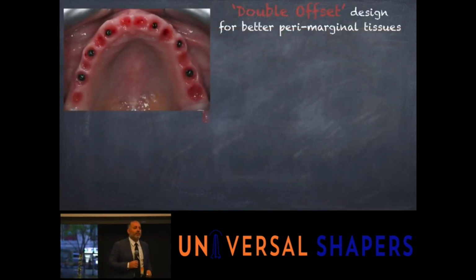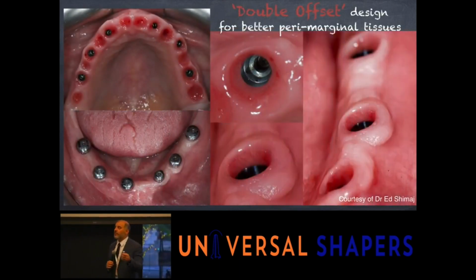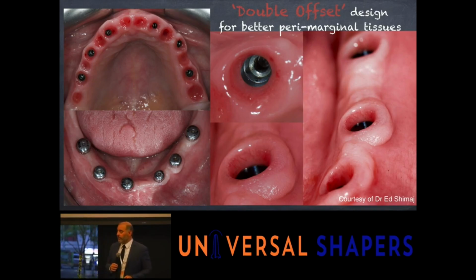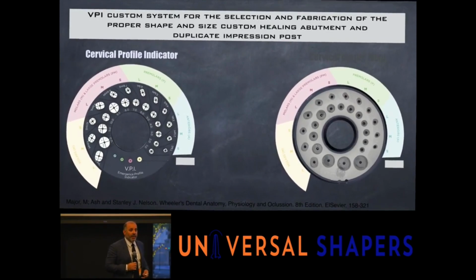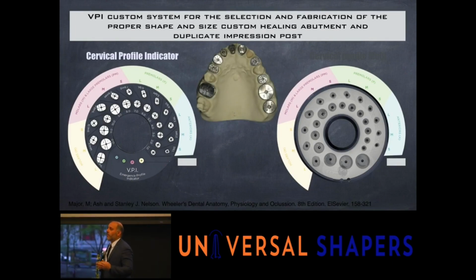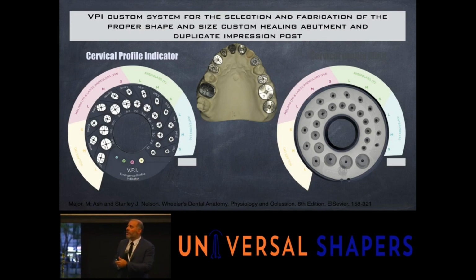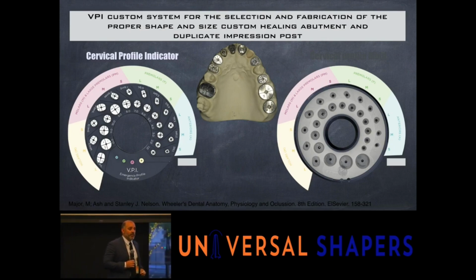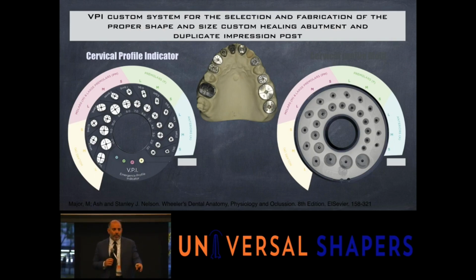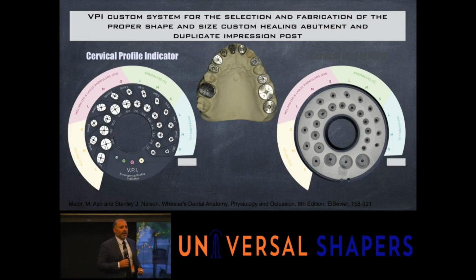So these double offsets can give us some really, really beautiful soft tissue. They can help us tremendously, especially in these all-on-X cases that we may handle. So just not even using such wide healing caps, you can see such beautiful soft tissue forming around the healing abutments. Some other solutions, if your system doesn't have that, you can simply buy a customized system, like the VPI system. My good friend Johannes makes this system where you can work with pretty much any implant, and you can make your healing abutments customized in different shapes, using a silicone indexer, using a temporary cylinder, and flowing composite around it, and then you go and place it into the mouth. I recommend using a hex abutment or a trilobe or octagon, whatever you're using, but an engaging abutment, not a non-engaging one, so it doesn't spin around as you put it in. That'll lock into place.